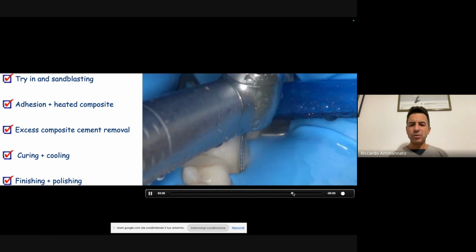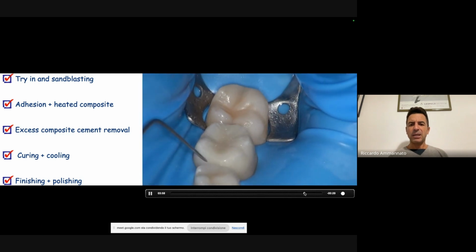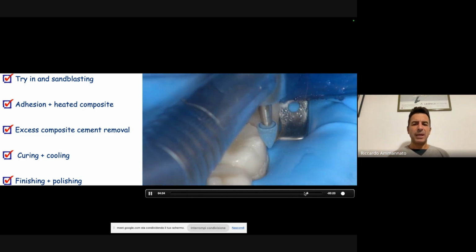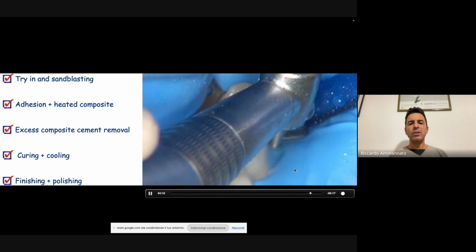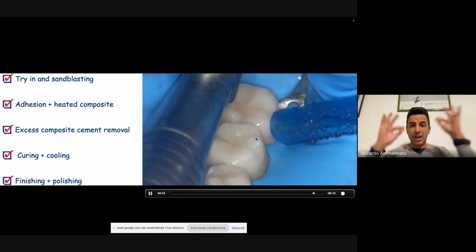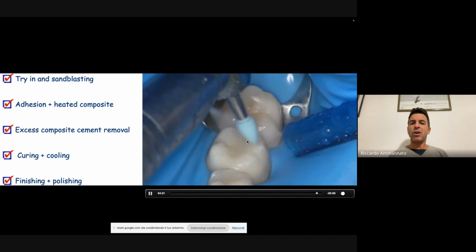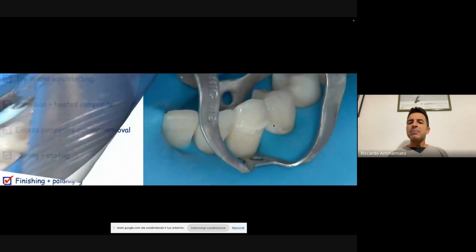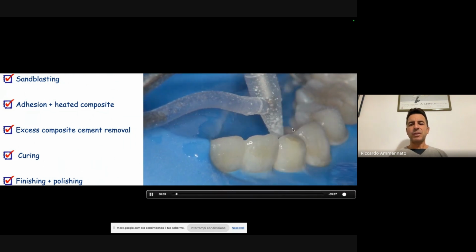Okay, and then I do a pre-polishing, I check if everything is smooth, no gaps, no overlaps or excess material. And then I use a pre-polishing point for the finishing area. I will obviously have to check occlusion later, so I'm not going to touch the occlusal side. And this is the polisher, but just on the buccal and lingual side. Same stuff, cementation of another video, but I'm just going to cut it so we can finish without any problems.